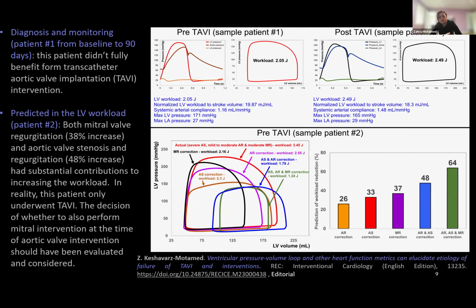There is one more case that I wanted to show. Everything that you see here are real patients. None of them are hypothetical cases. And for all cases we validated, because we also have access to the actual case after TAVR, and we validated the situation either with catheter or Doppler, sometimes with CT, in terms of quantity or quality. This is another case where post-TAVR load actually increased.